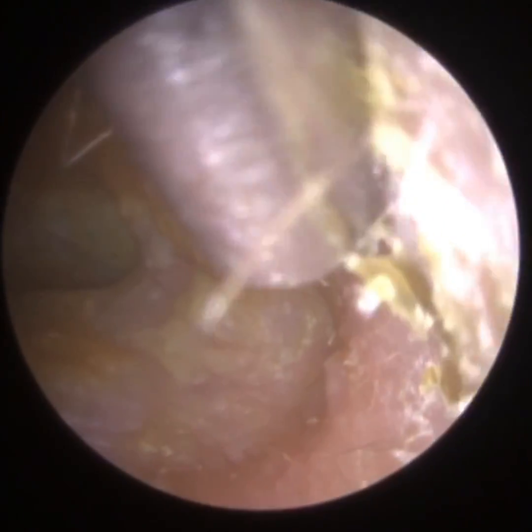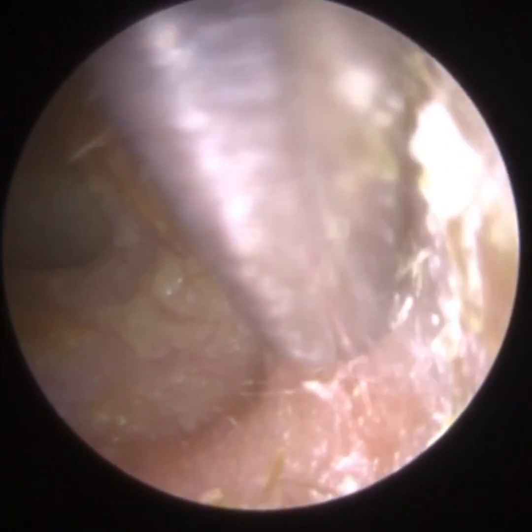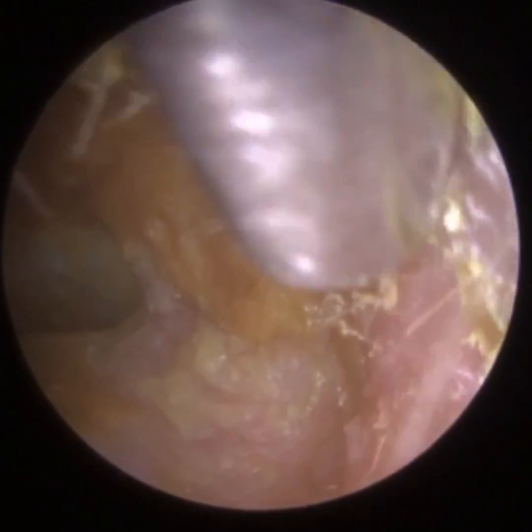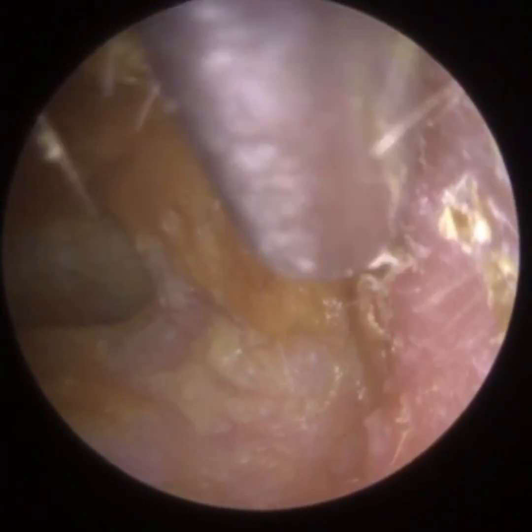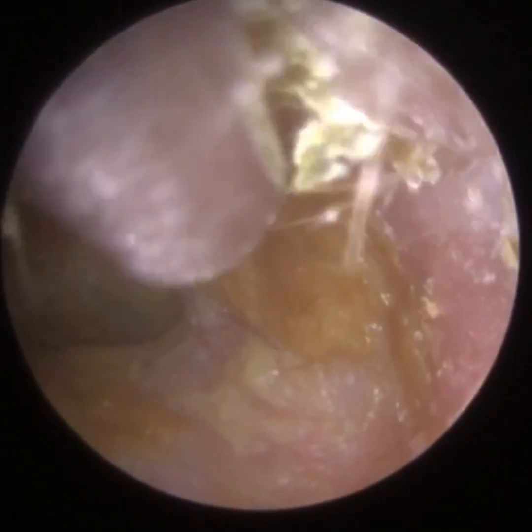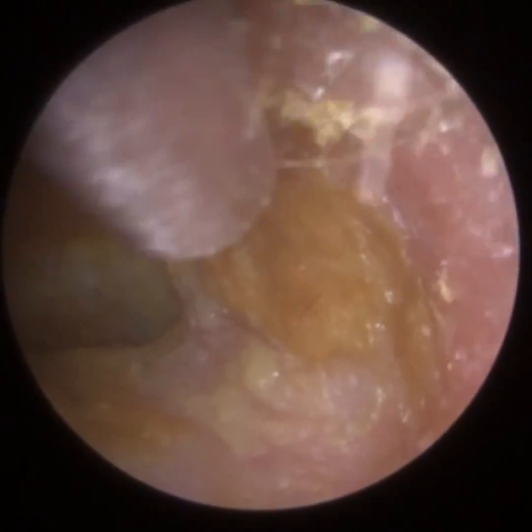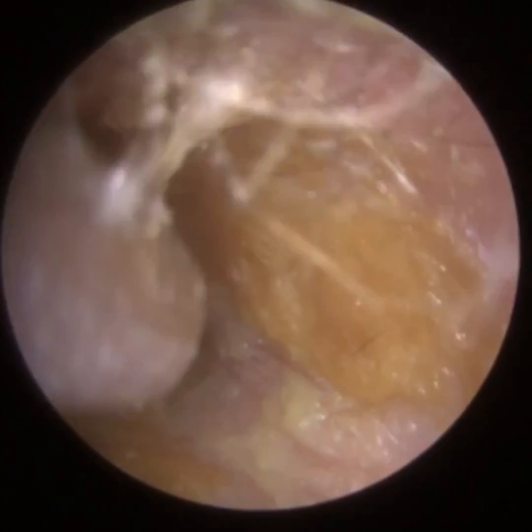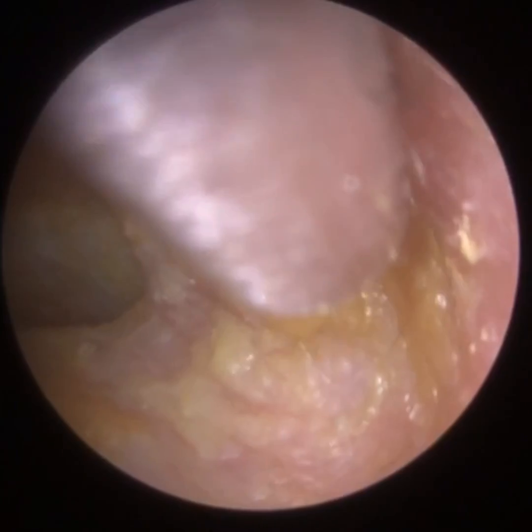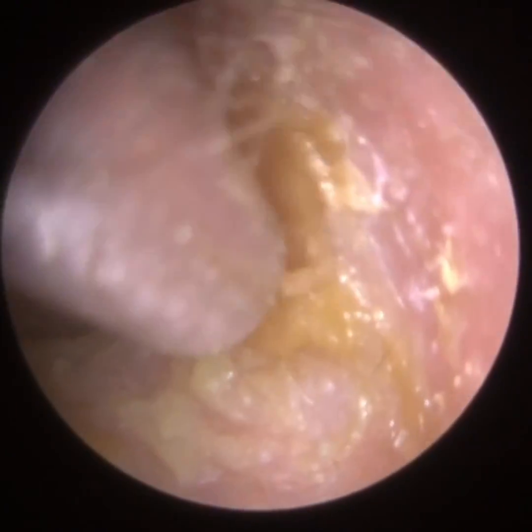Now, it's very difficult because the outer third of the ear canal is cartilaginous, so we can apply some pressure like we are here. But when you get to the inner 2/3 of the ear canal, it's very sensitive. When we train our Clear Wax delegates, I always make reference to that game of Operation. You may have played it, where you've got different parts of the body, different objects, different bones, and you've got some tweezers, and you've got to remove it without touching the side. For example, if you're removing the femur from the leg, there's this electrical sensor, so if you make contact with it, the buzzer comes on.